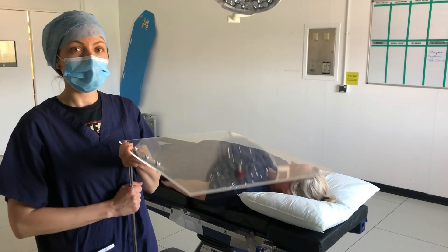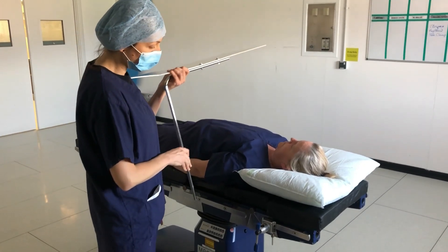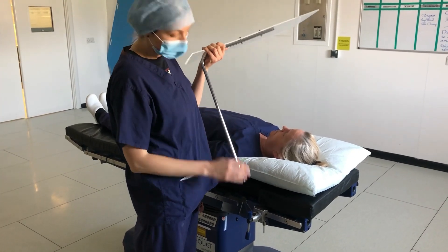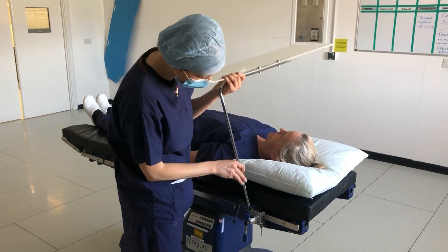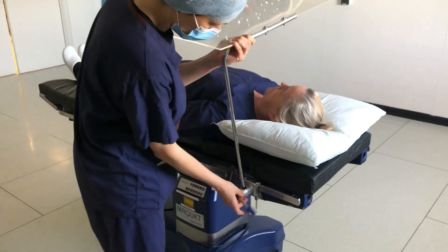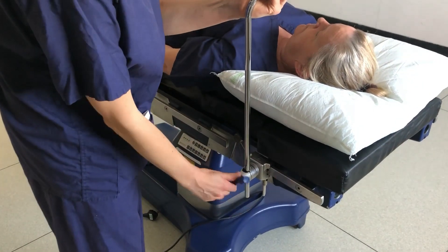This is the perspex table, a see-through barrier during aerosol generating procedures. Once the patient is positioned and draped, we mount the table using either the operating table clamp or the Mayo table base. We can secure it at the required height.